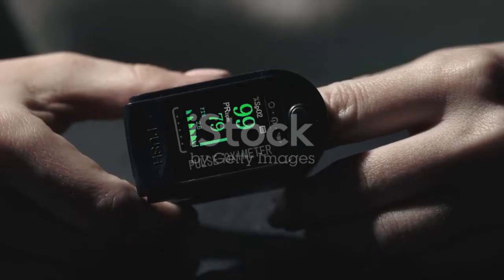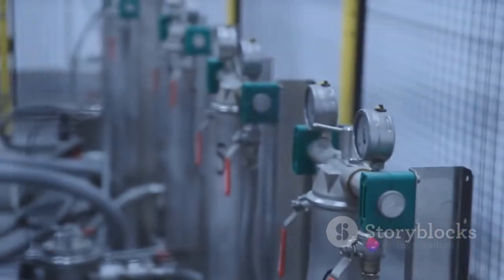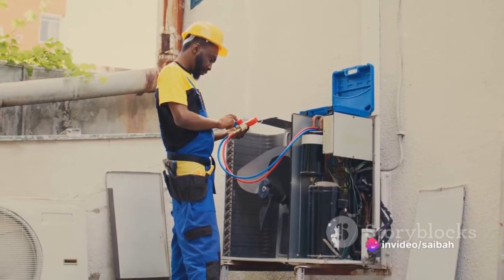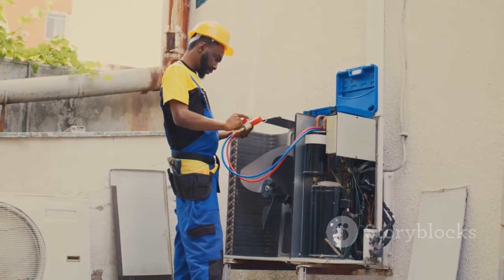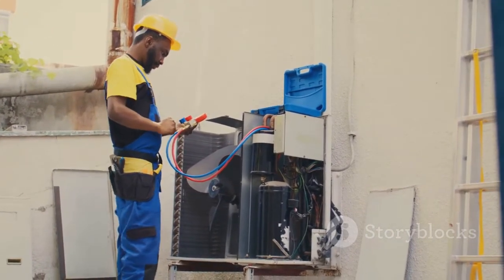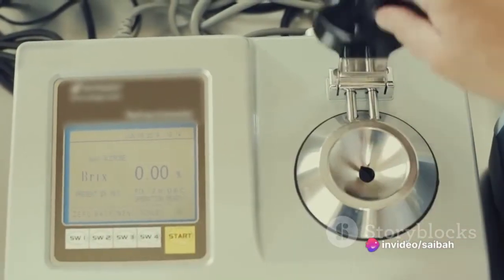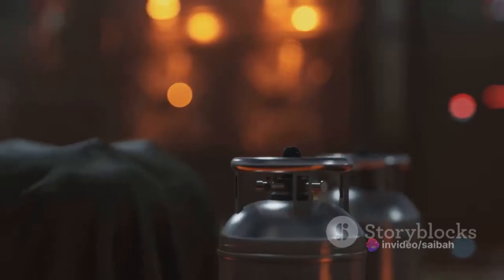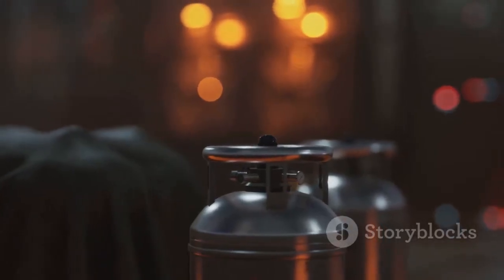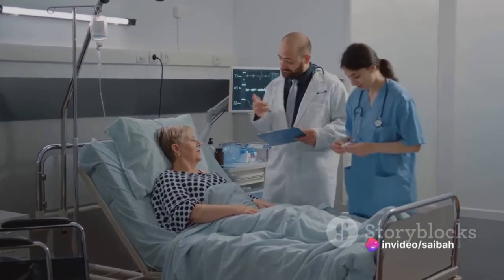Like any precision instrument, an oxygen analyzer needs regular calibration to maintain its accuracy. Calibration is a process that verifies the analyzer's measurements against a known standard, ensuring that it can provide reliable and accurate readings. We're going to walk through the entire process in this video — how to understand the calibration process, how to perform the calibration, and how to verify the results.